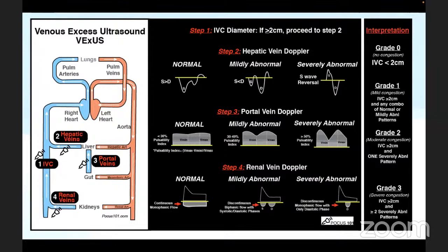But where there is a pathology with congestion only in the kidney and liver and not much in the lungs, as in CLDs, IVC collapsibility or index won't work in a very good way. So in those patients there are a lot of limitations. IVC per se has a sensitivity of only 41%.